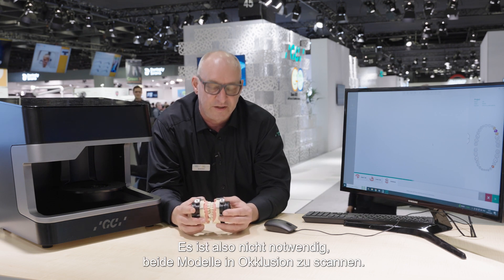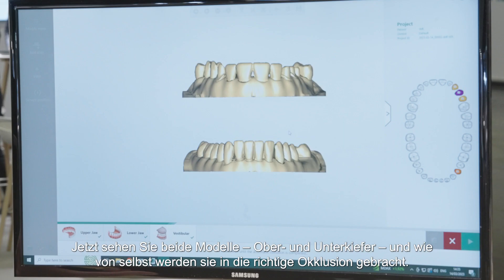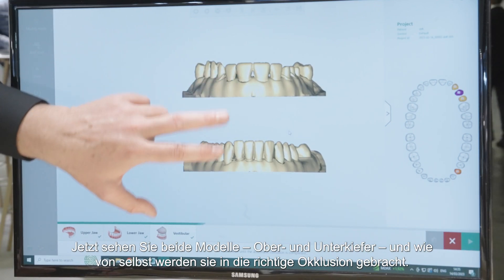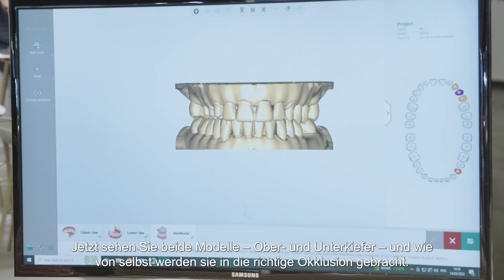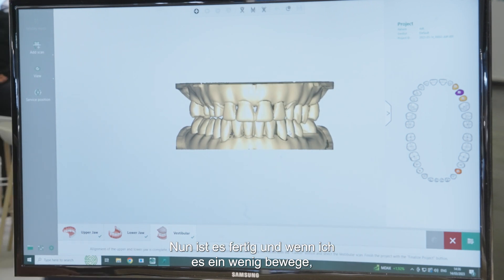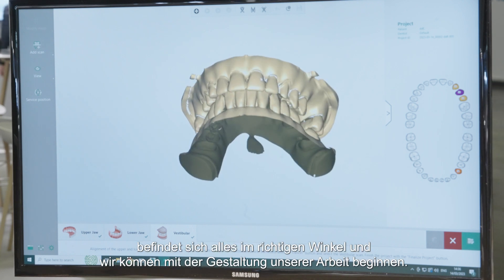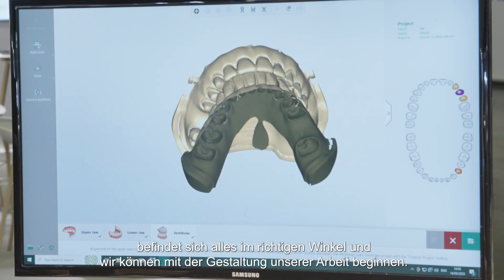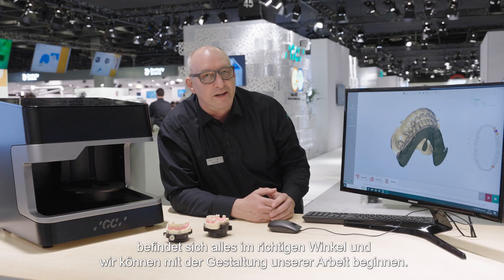It's not necessary to scan both models in occlusion. Now you see both models — the upper and the lower jaw. After that you will see like magic they fly into the right position. Now it's finished. If I move them a little bit, you see everything is in the right occlusion. Now you are finished and you can design your work.